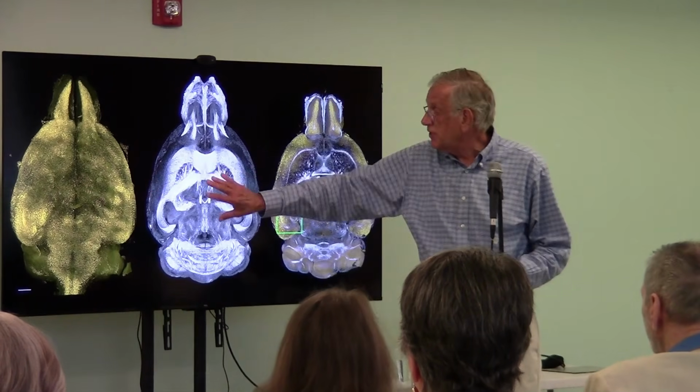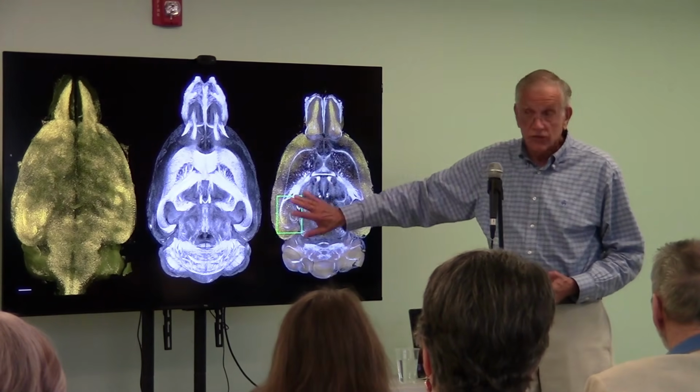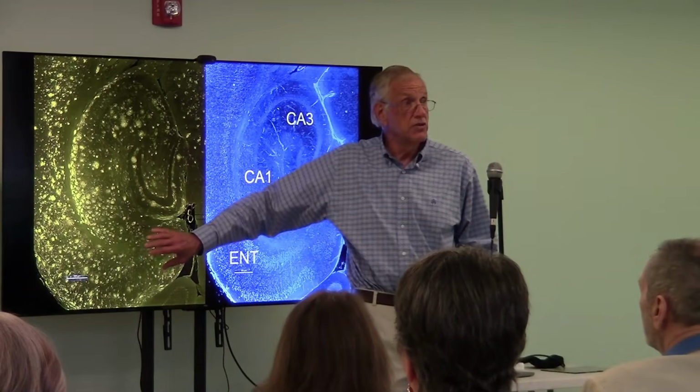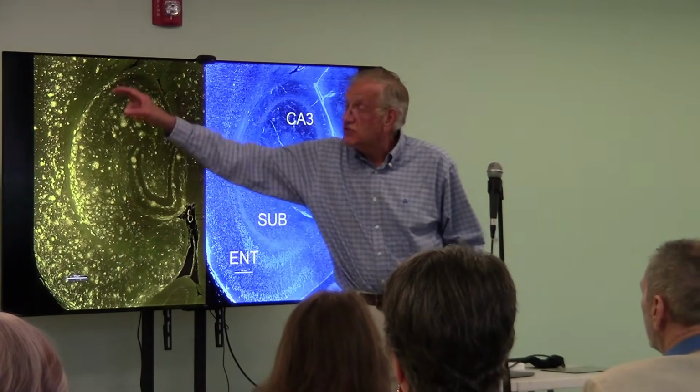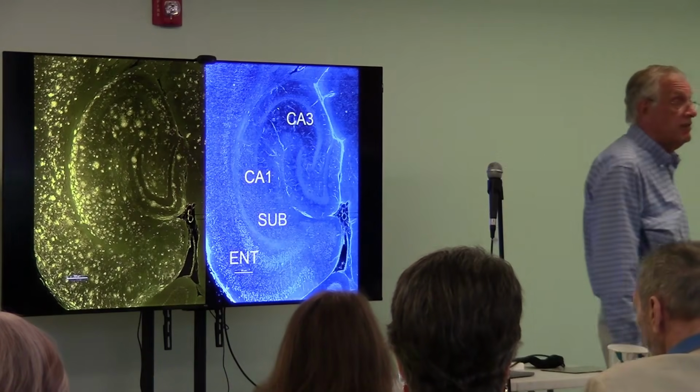This is the MR 3D. Here is a 2D version of it, registered together. We can zoom in. At this spatial resolution, we can say, tell me what the percentage of that area or that volume is A beta.